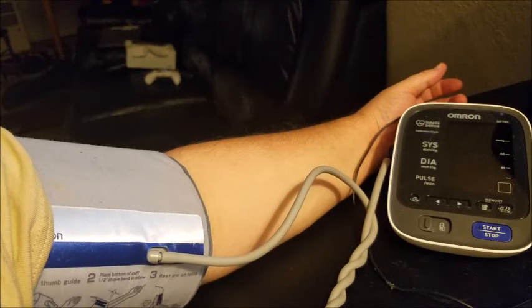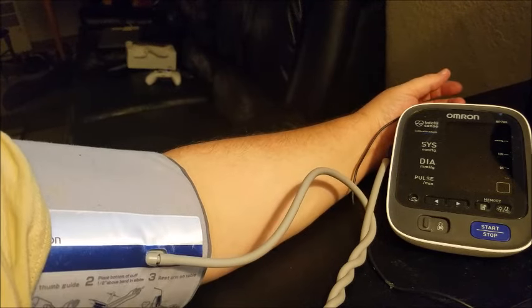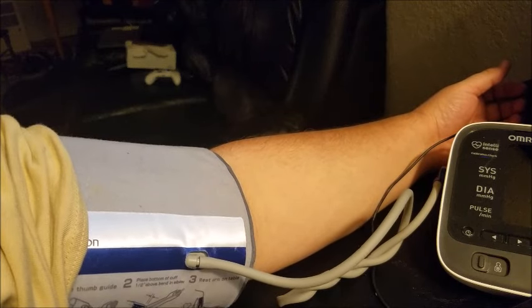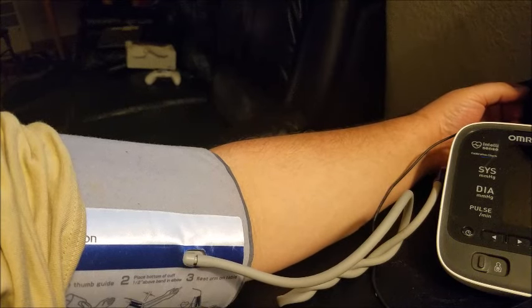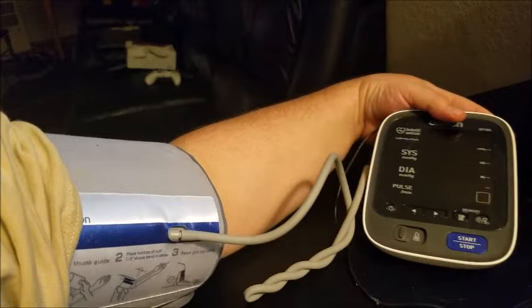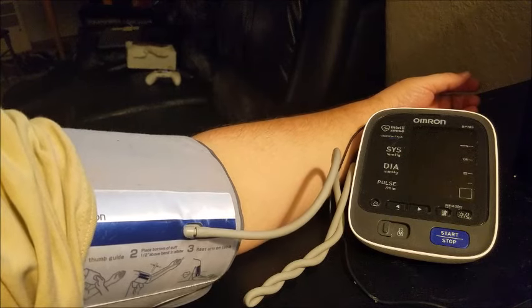I want to show you guys how to possibly fix the ER error messages on your Omron blood pressure device. This is a particular one that's an IntelliSense BP-785. I'll consider it a newer model because they go back 20-some years. The error I've been getting is an ER-4, but this should work with a lot of the errors.